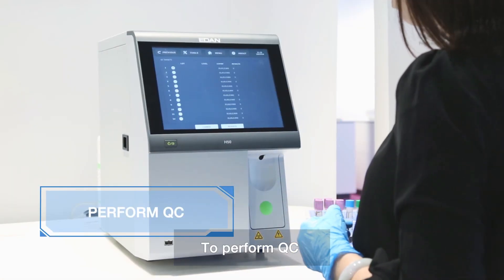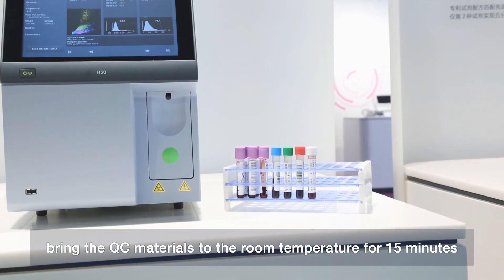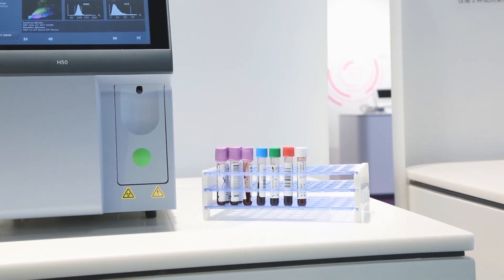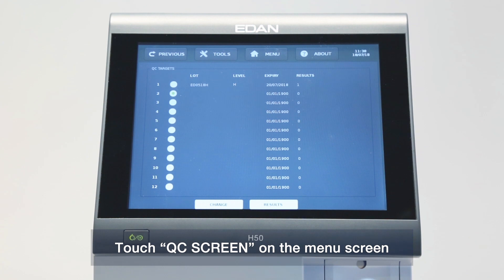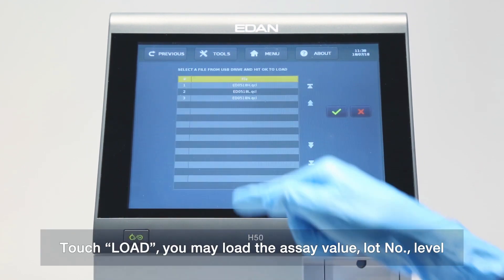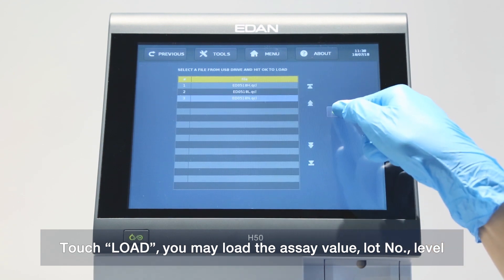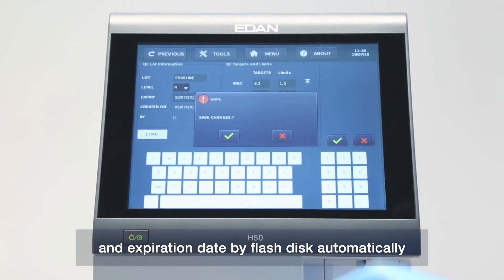To perform QC, bring the QC materials to room temperature for 15 minutes. Touch the QC screen on the menu screen. Touch Change to create a new load, then touch Load. You may load the target value, lot number, level, and expiration date automatically via flash disk.